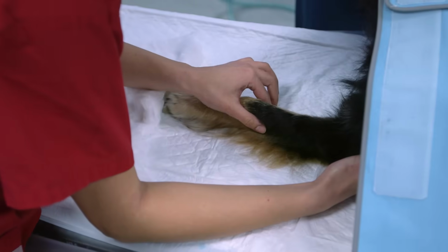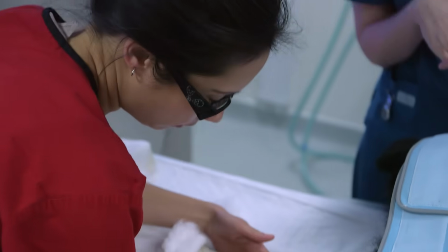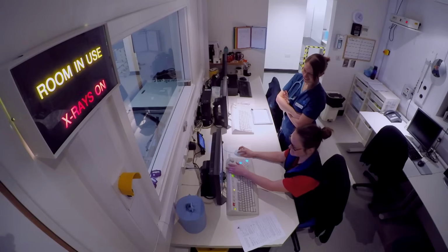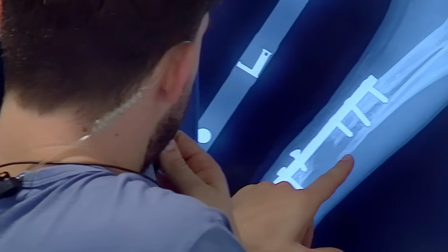If the plates are down. But there's a high risk of fracture with it as well, so we don't want to move too much. Noel will now attempt to grow new bone to bridge a 4-centimetre gap in Izzy's leg. If successful, Izzy will be Noel's first patient to benefit from this groundbreaking treatment.